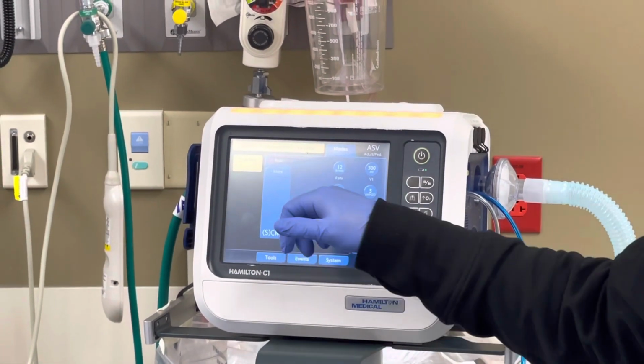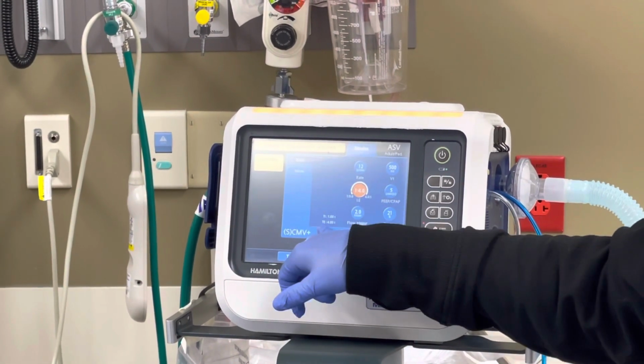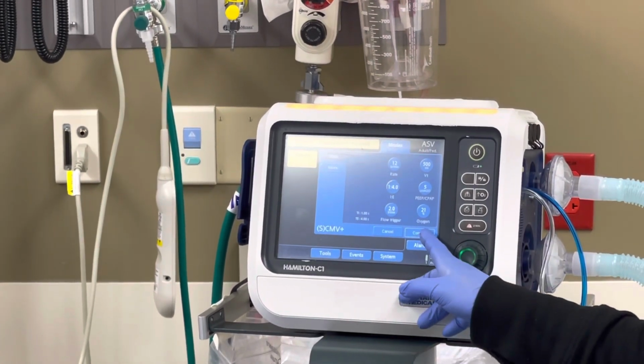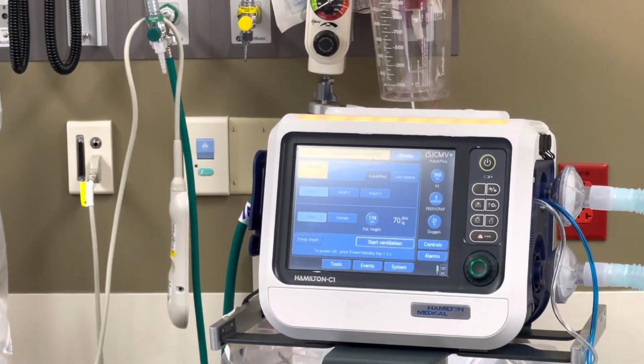Okay. And then I'm gonna look at my I to E time. So right now off of 12, my I time is 1 second, which is appropriate, so I would leave it there. And then I would hit confirm. Any questions on that? No?